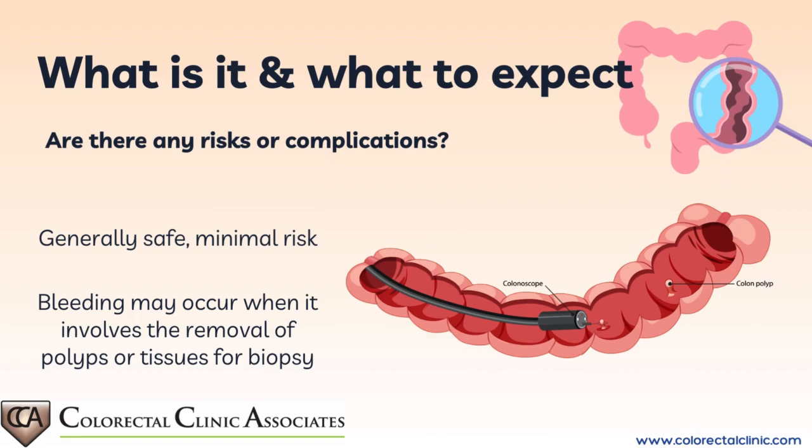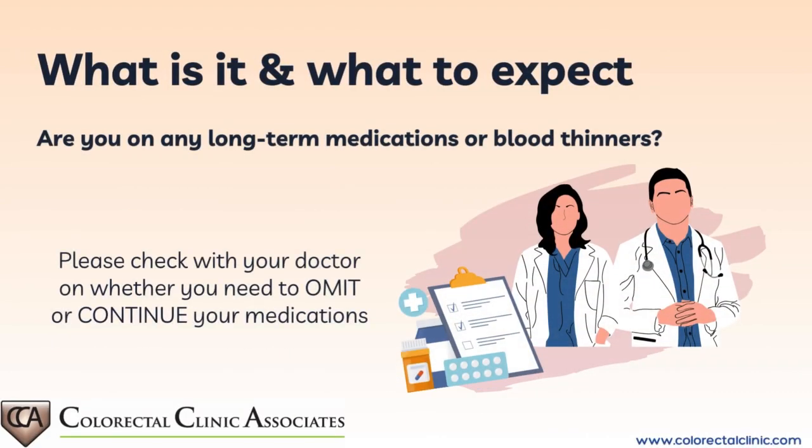In general, gastroscopy and colonoscopy are safe procedures. The risk of perforation is 0.1 to 0.3%, and the risk for bleeding is 0.1 to 2%. Bleeding may occur when the procedure involves the removal of polyps or tissues for biopsy. In most cases, it is very minimal. Please clarify with your doctor if you're currently on any long-term medications or blood thinners, so we can advise you to either omit or continue your medications accordingly.